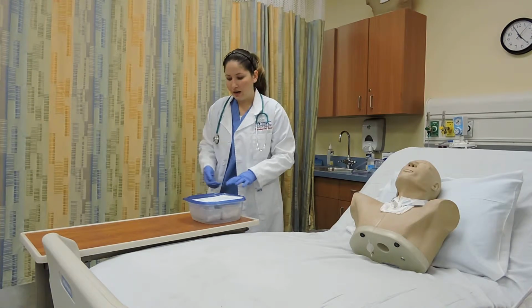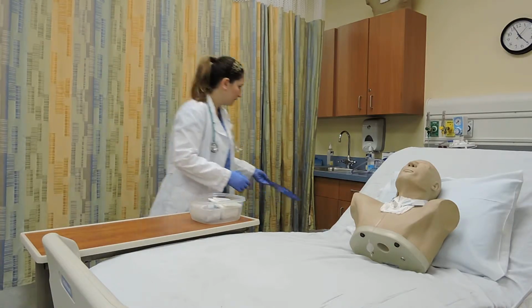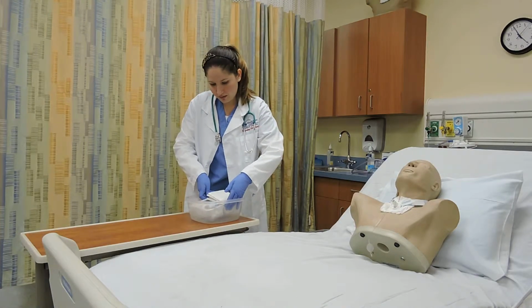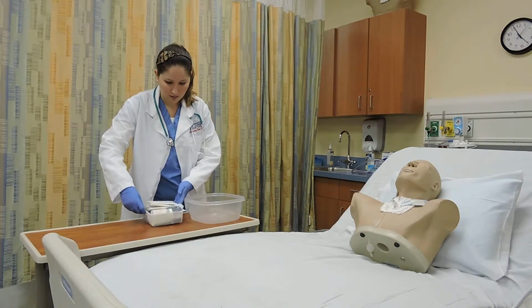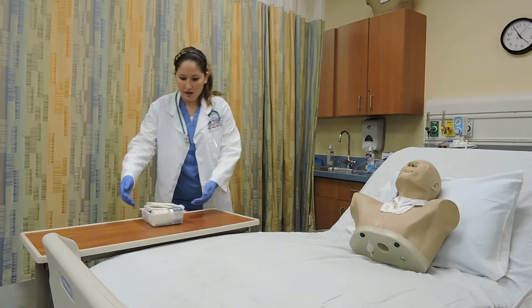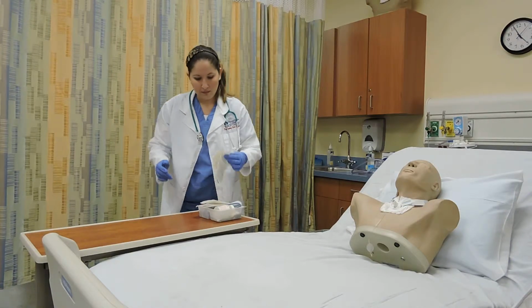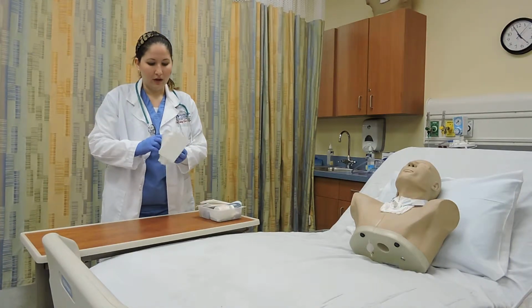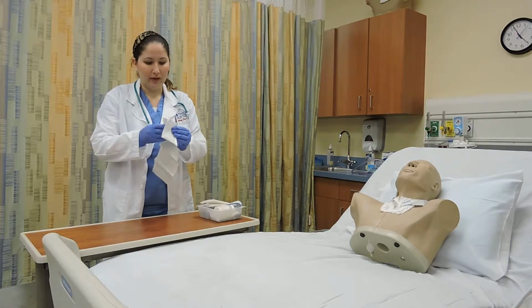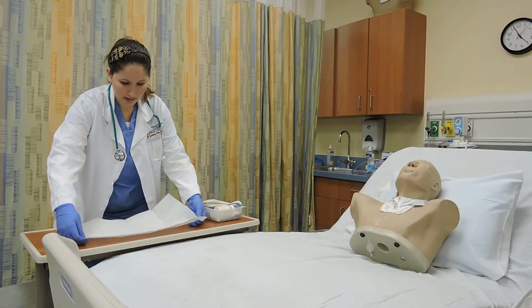I'm now going to open up my trach care kit using aseptic technique. The first thing that we're going to find is the sterile field. I'm going to open it and make sure that the side I'm touching is the side I'm placing on the bottom, making sure that everything on top stays sterile.